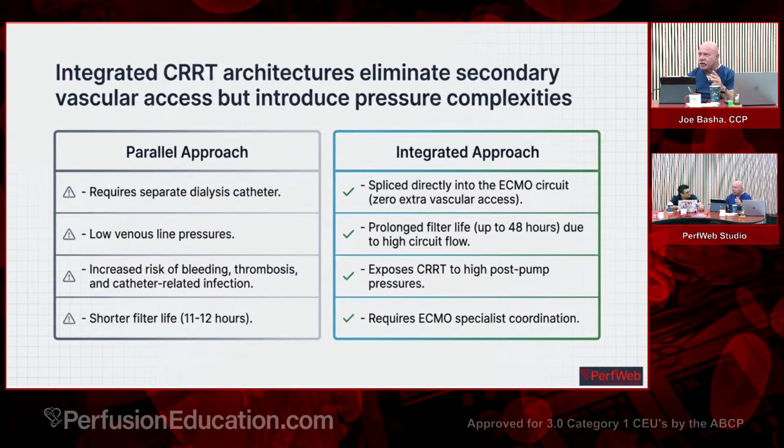Also recommends that for ECMO specialists or nurses at the bedside managing the ECMO, your circuit have zero open connections, stopcocks, Luer locks, whatever, on the negative or positive side. Okay. Zero. Even on the positive side. Even on the positive side. Well, you want to... There was air, you'll just lose volume.